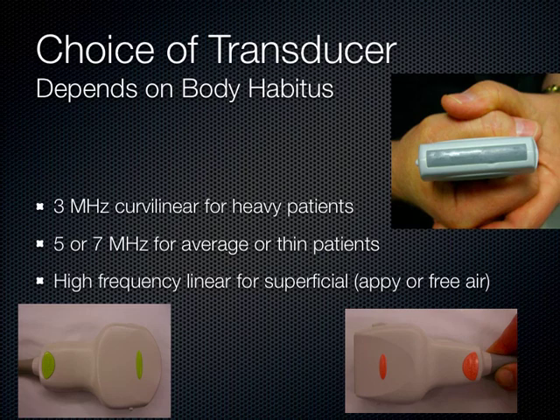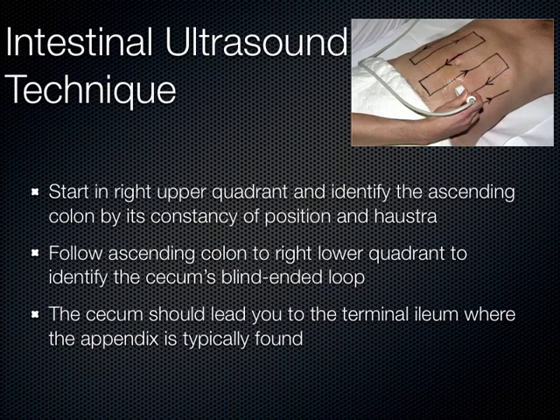This linear probe is my transducer of choice for bowel. If I have a very large patient, I'd lean toward a lower-frequency curvilinear probe like the C60. That said, the linear transducer can usually handle most intestinal ultrasound. What we're going to do is called 'mowing the lawn' — starting in the right upper quadrant to find the ascending colon, which has haustra.